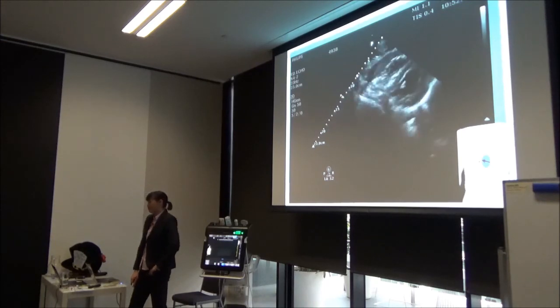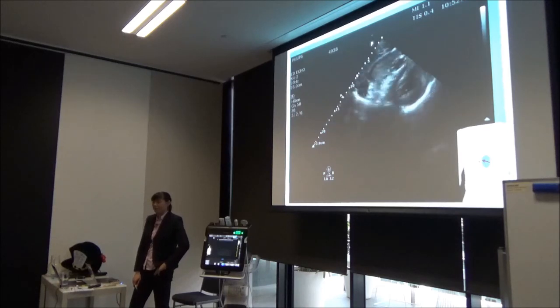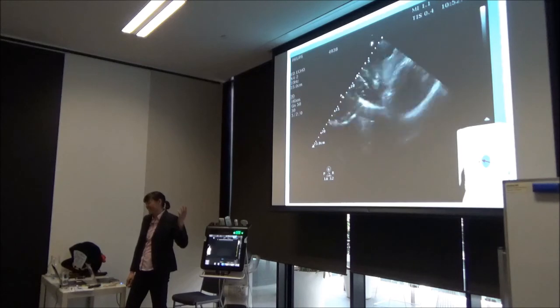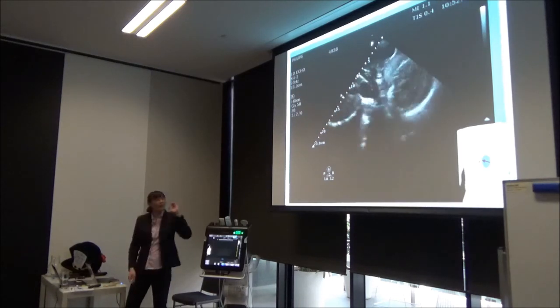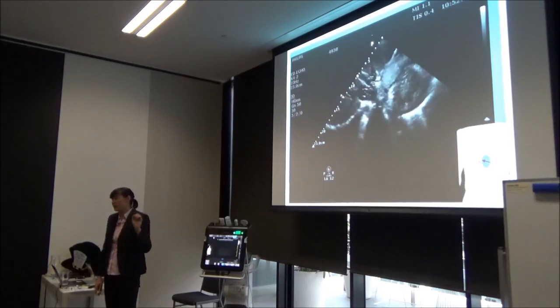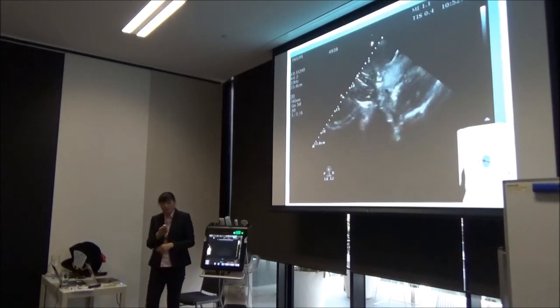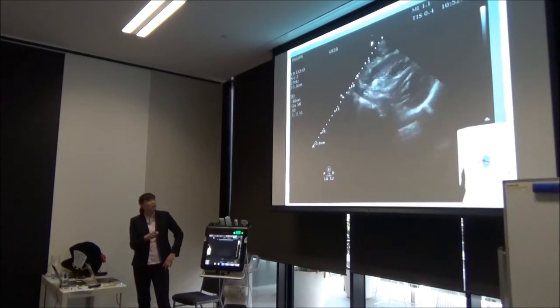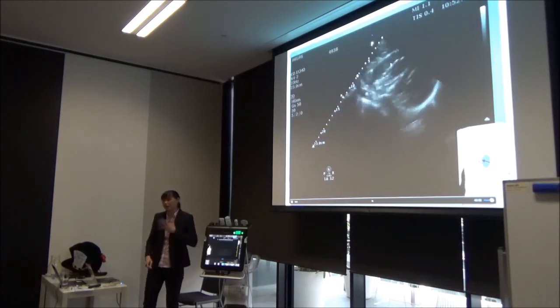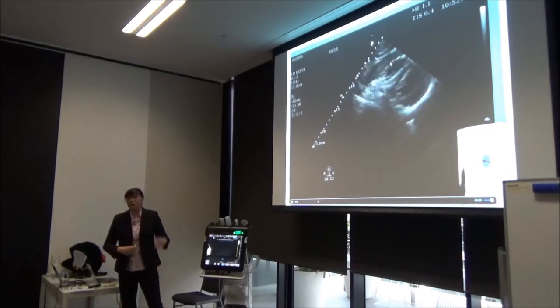How's the squeeze of the heart? Do I have an effusion? Does this look really weird to you? Yeah. Is it a mechanical artifact? So this one, it was mechanical action. This is what happens when you're looking at compressions under CPR using TTE. This is a subxiphoid view, or subcostal view. This is my liver, and here's my heart. So this is what happens. The machine, the LUCAS is on, and your liver is going underneath it in a subcostal view to get this.